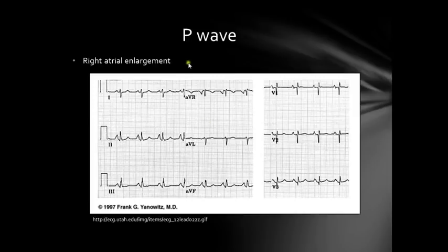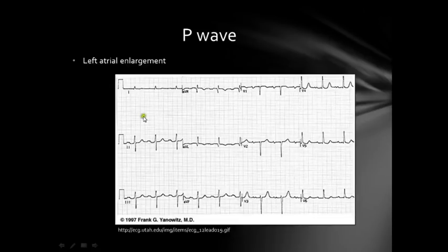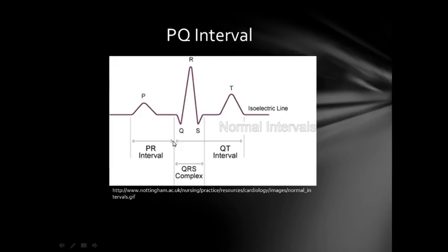Here is an example of right atrial enlargement — look at lead 2, the P wave is very large. This is left atrial enlargement — again, look at lead 2; you can see the P wave looks like an M here and also here. So this is left atrial enlargement.